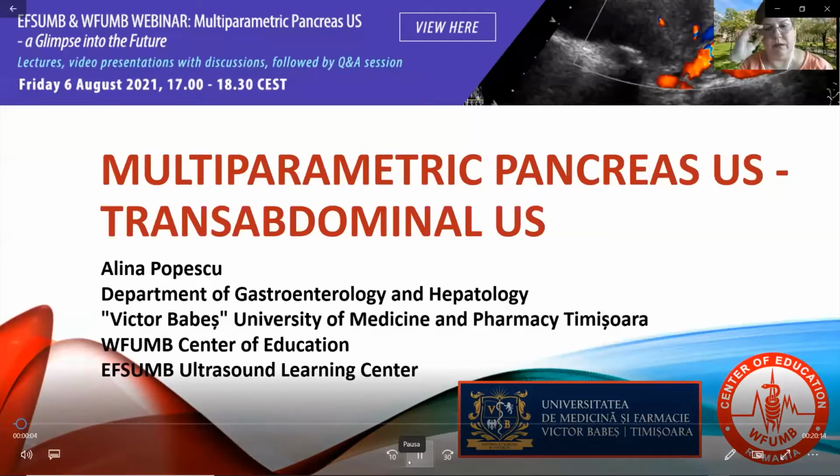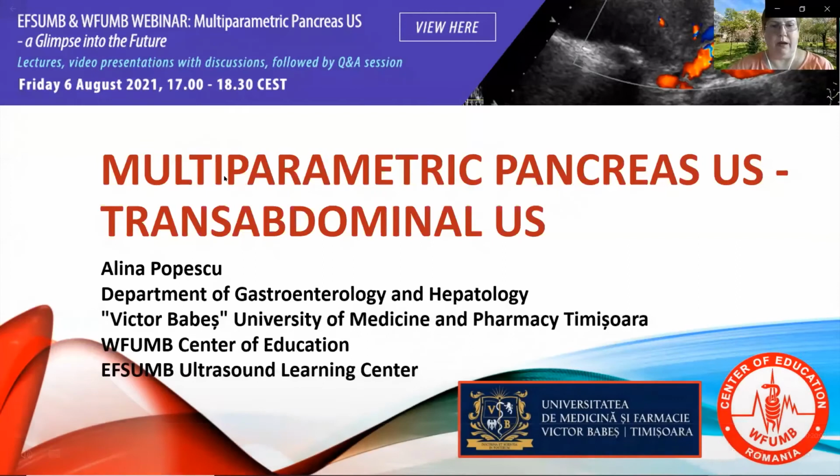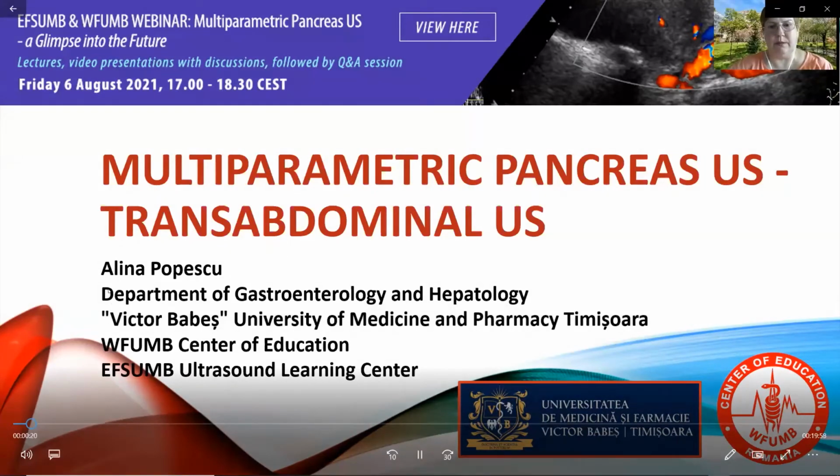Hello, everybody, and welcome to this interesting webinar about the many phases of ultrasound and how we can use these techniques for the evaluation of the pancreas. I have the task to show you what transabdominal ultrasound can offer us together with the many techniques that are available when we talk about pancreatic pathology.